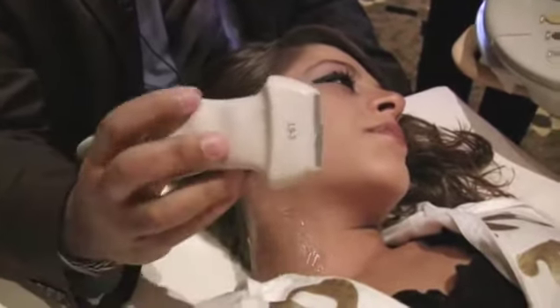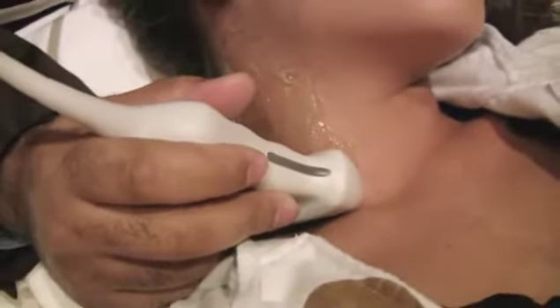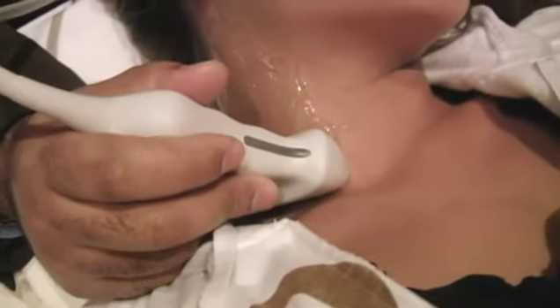And we're going to start out the evaluation at the base of the neck, as far down as you can go, and identify the origin of the common carotid artery. Now, the anatomy is a little bit different on the right than it is on the left. And on the right, you can almost always identify the origin of the common carotid artery.